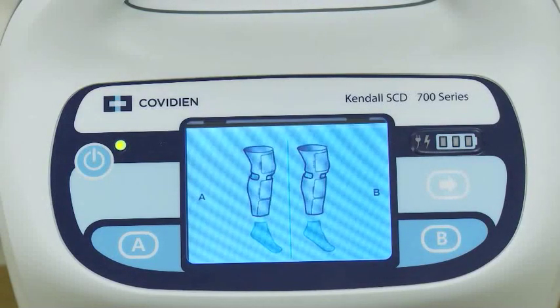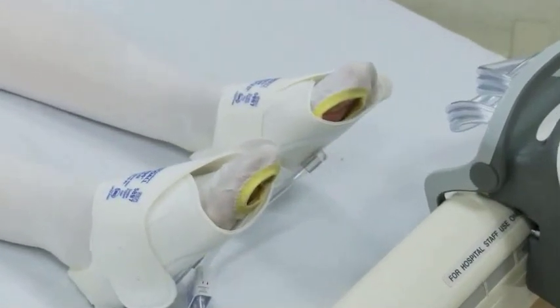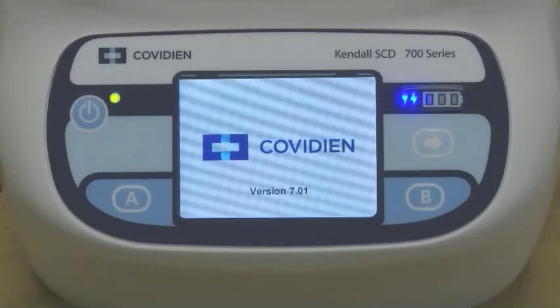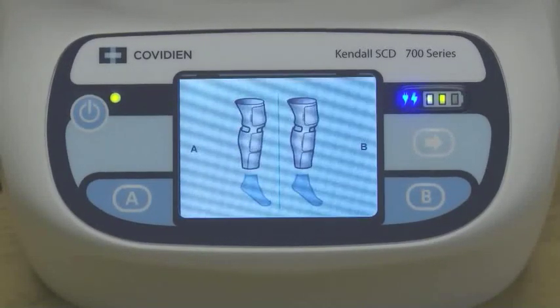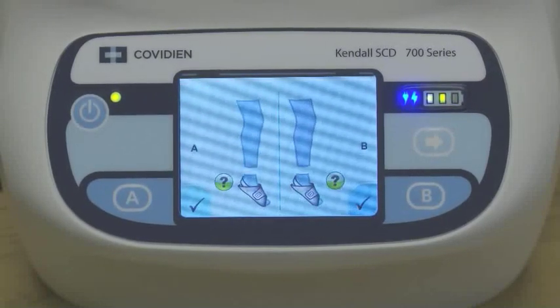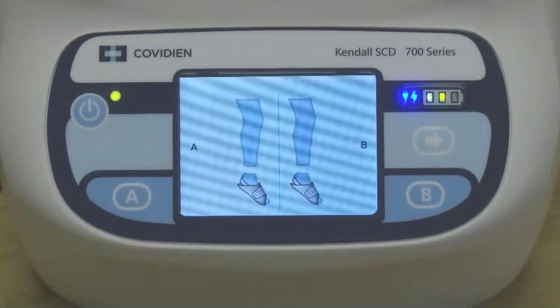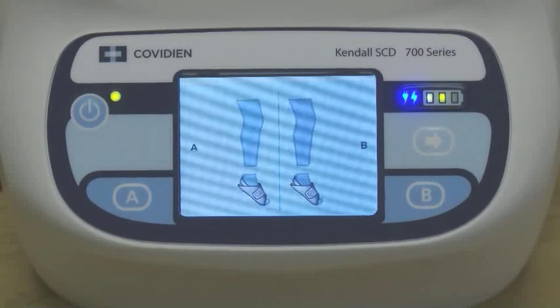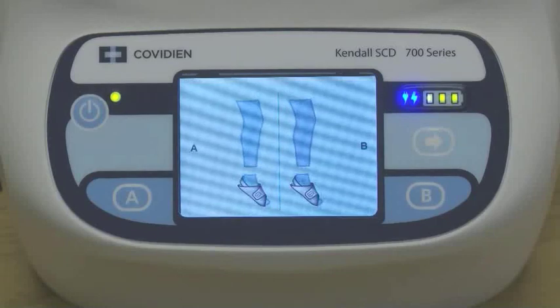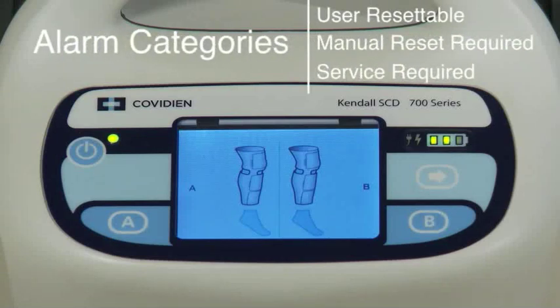For leg or foot garment detection, the 700 series will detect garments on the patient's limb and will show this on the LCD screen. If the foot cuff option is being used, simply follow the same steps as the leg sleeves. Once applied, one-touch operation will start the pump. Foot cuffs will be detected and shown on the LCD screen. Confirm the foot cuff option by pressing the A and B buttons that coincide with the displayed check marks. The 700 series 3.2-inch color LCD screen helps end users easily recognize and resolve alarms through animated alarm resolution. The 700 series has three alarm categories: user resettable, manual reset required, and service required.